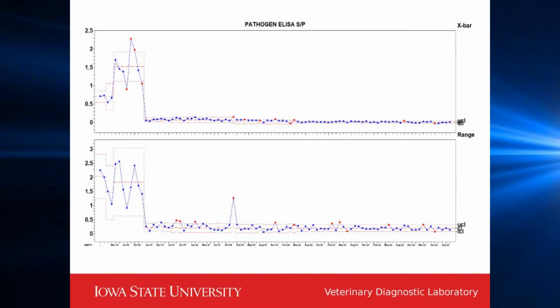And then, this is January of 2017, then a significant process change happened. And the process change was that the infected population of females was depopulated and repopulated with what were expected to be pathogen negative replacements. And over the course of the next several years, it appears that the expectation of those replacement animals being negative was correct. And I'm making that conclusion based on the X bar R chart above and the average value of each set of samples that came from the farm into the diagnostic lab over these years.